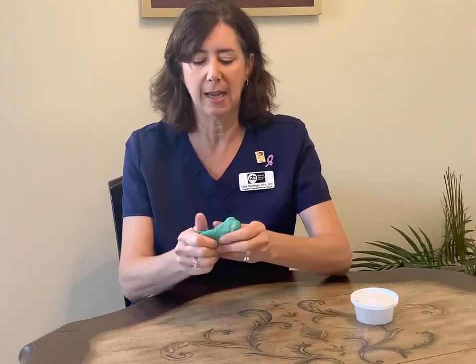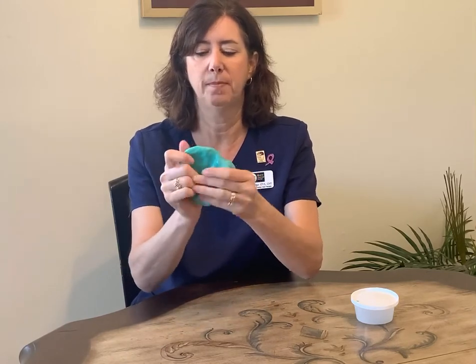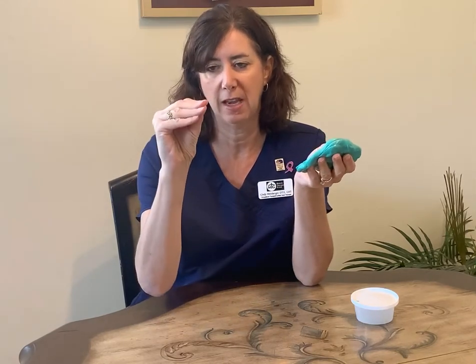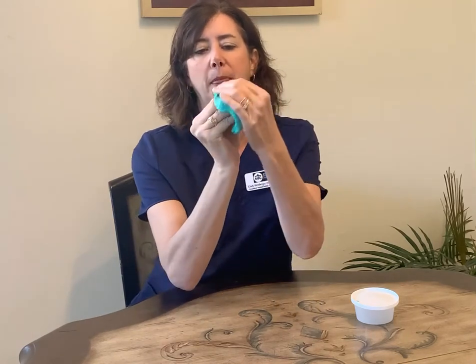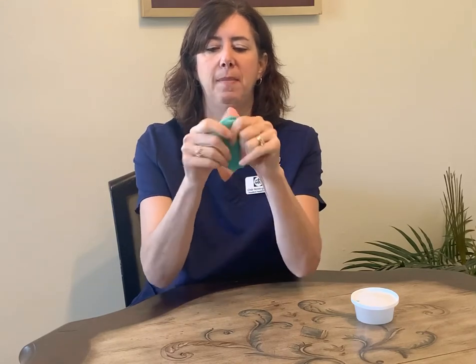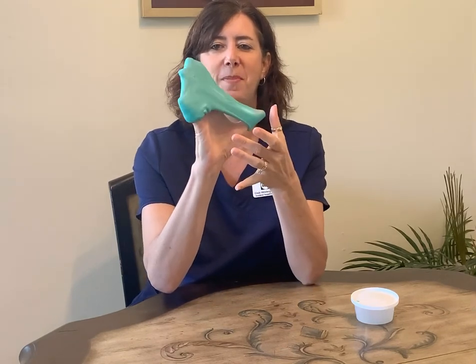Another exercise I like is to make this into a patty, like this. Bring your fingers and thumb together like a sock puppet position. Put the putty over the top, and then you're gonna open your hand. So this is an extension exercise. So again, you're gonna make it into a patty, over the top of your hand and fingers, and then open.